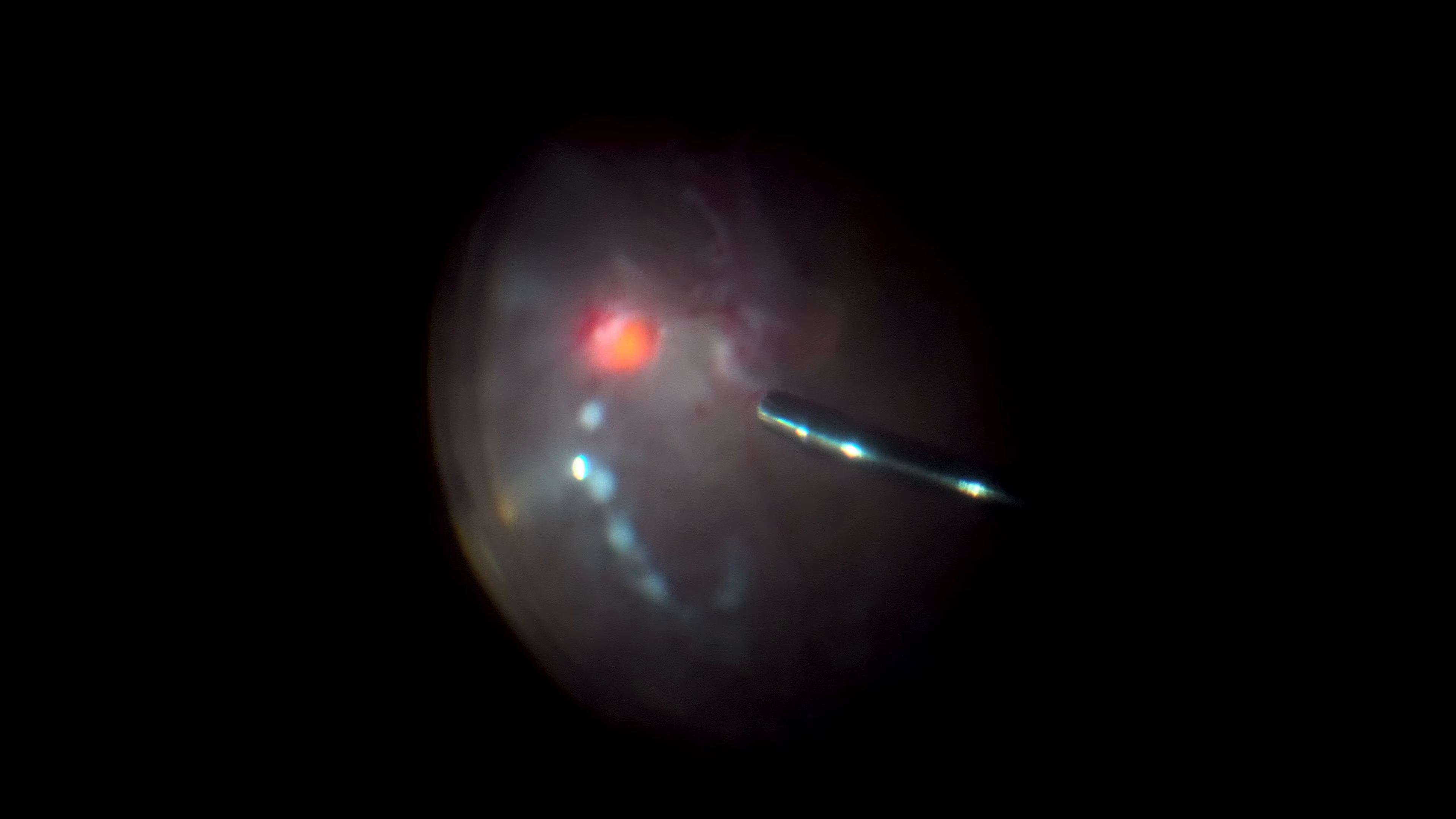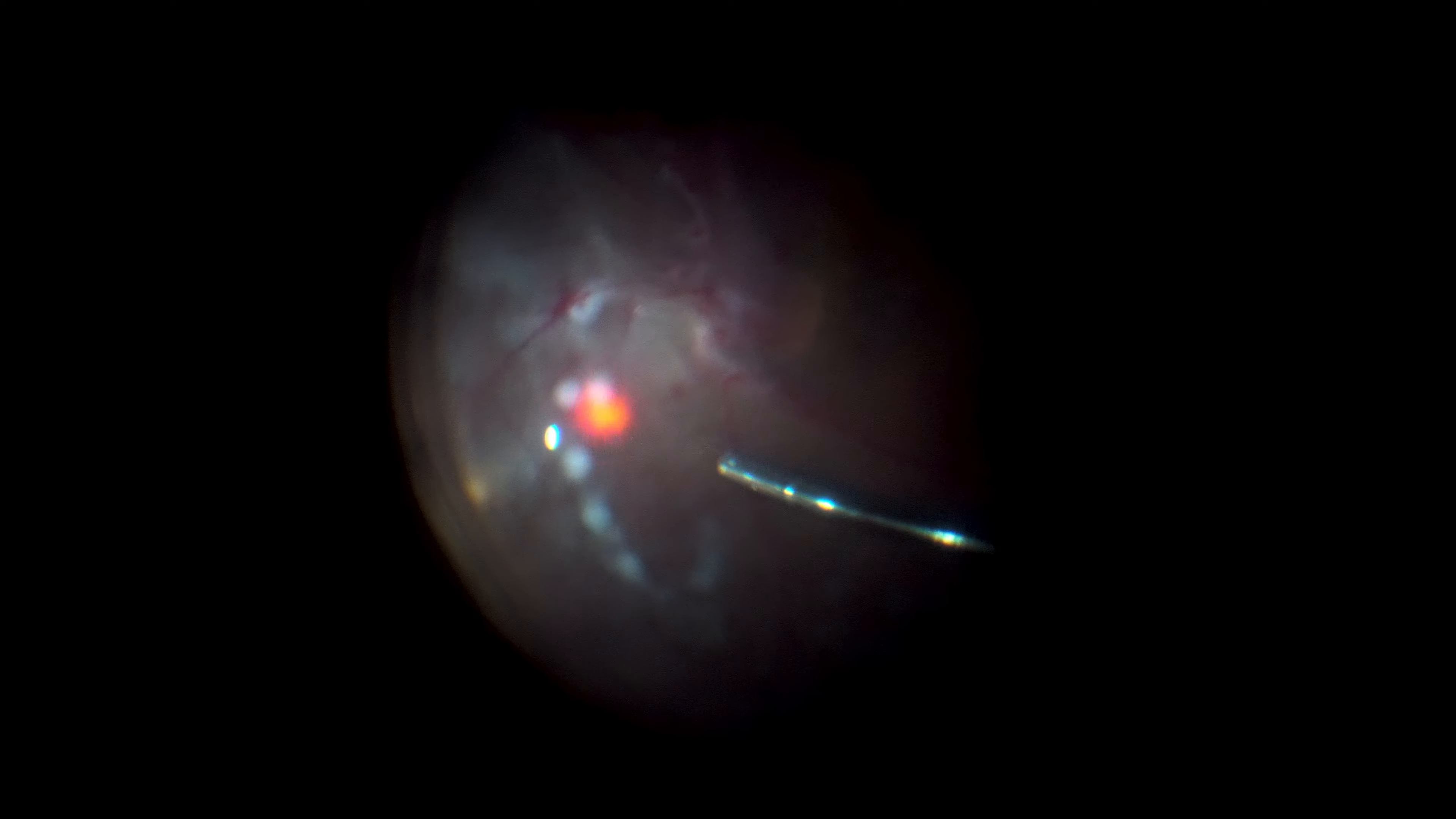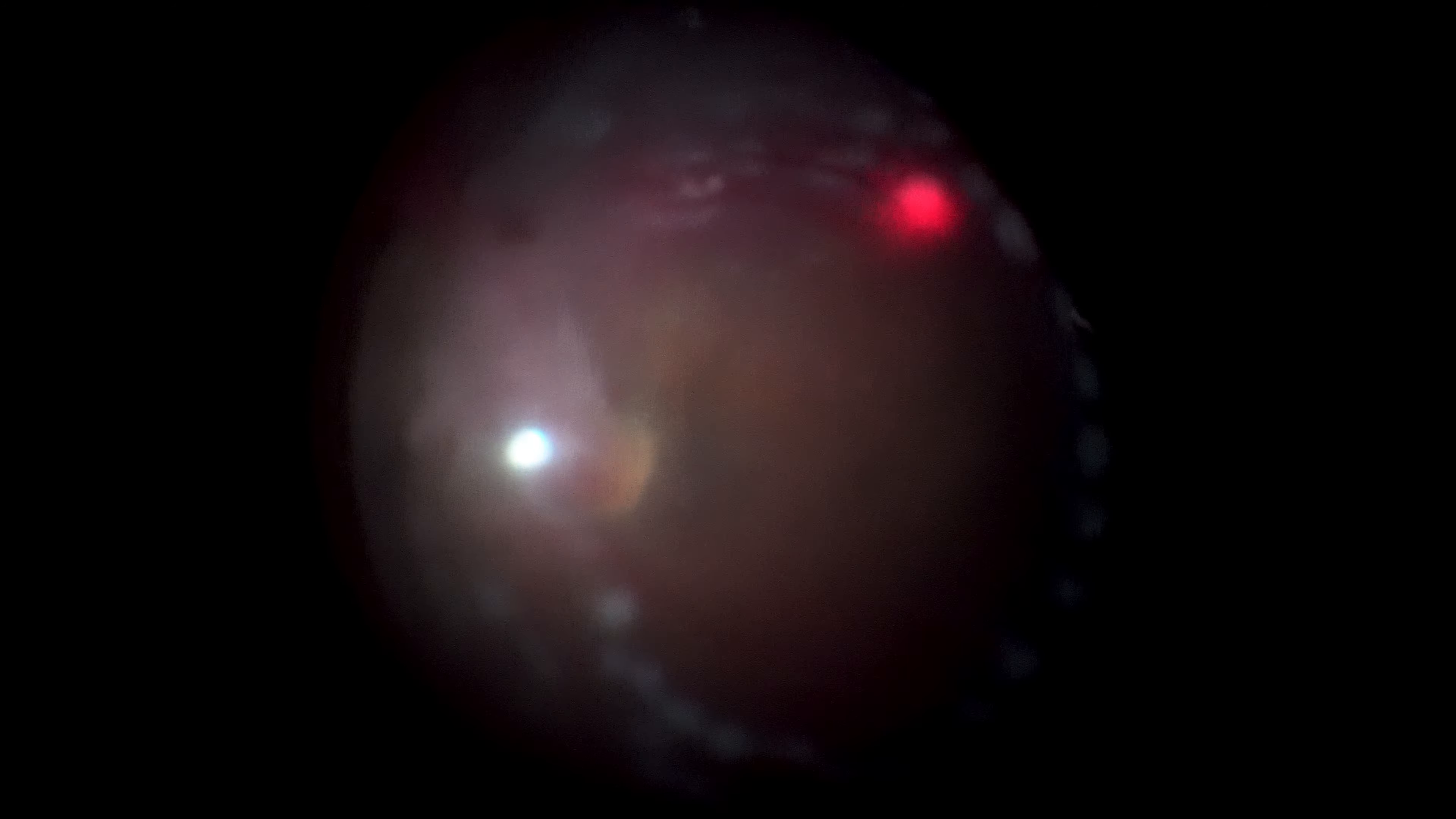It is time now for lasering the retina with panretinal photocoagulation. Try avoiding bleeding areas. Keep half-spot spacing evenly all over the retina. Do not go too close to the retina. Have a good uptake so the laser will be effective. The retina is flat enough for laser; detached areas should be covered also with barrier spots. Keep the macula free and go concentrically to do as much laser as possible.